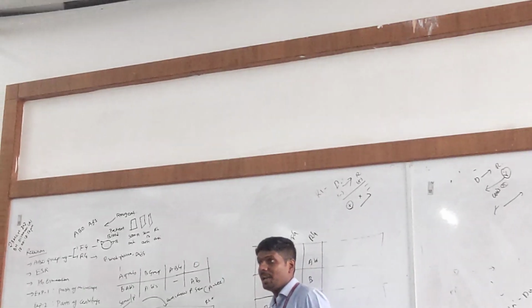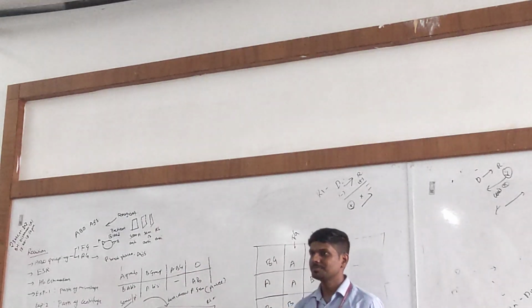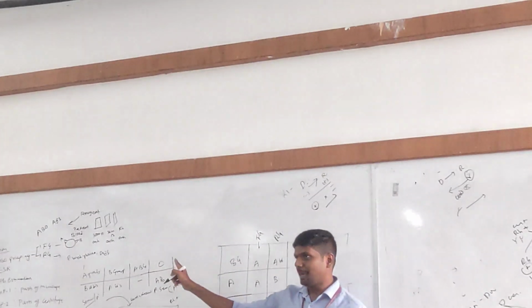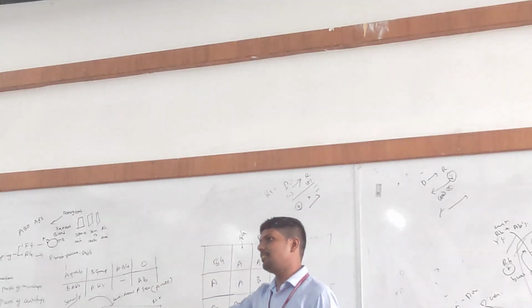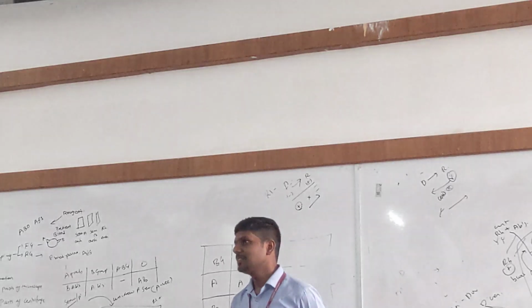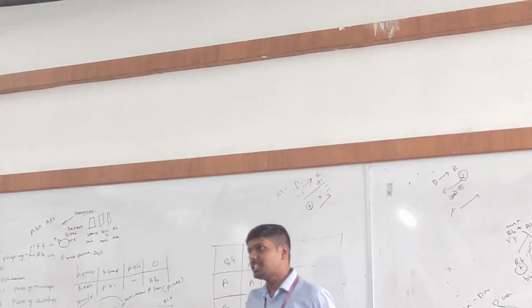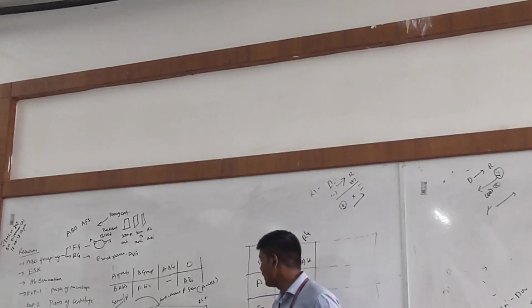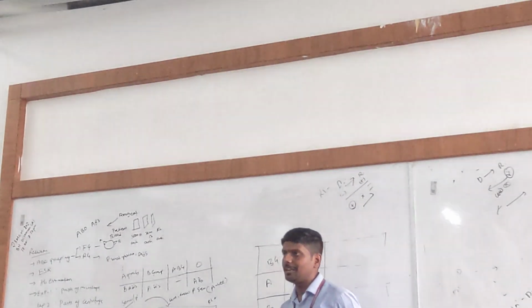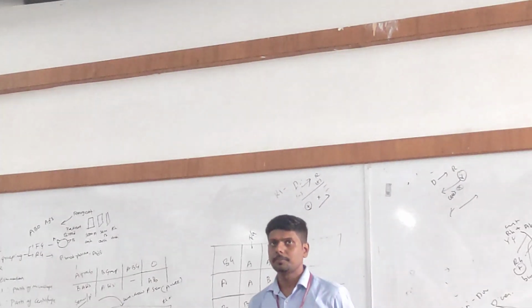Ideally, a negative mother should not have the antibodies, but why did her serum react with RH positive cells? I think she was sensitized somehow and she developed antibodies. In this case, we should not transfuse this blood to her.